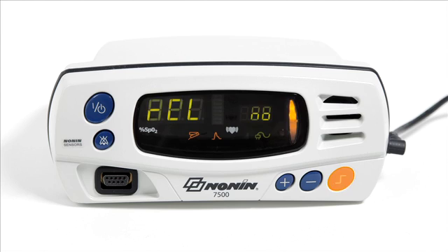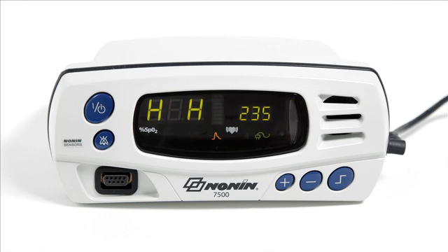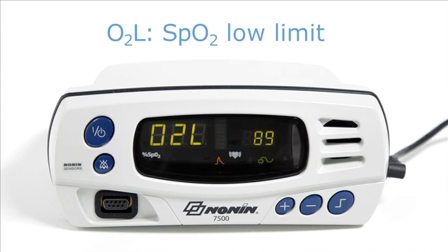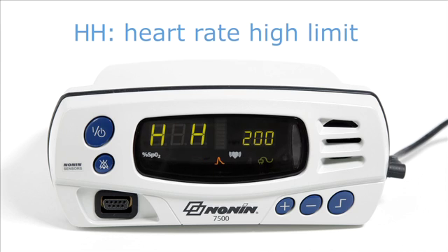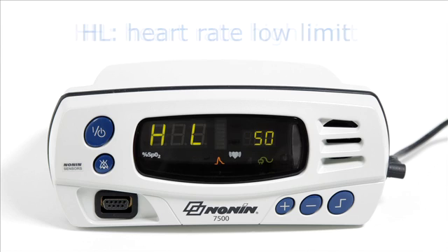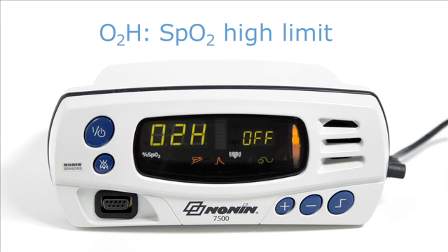You can proceed to the next limit value with each limits button press. Press the plus or minus button to increase or decrease the value to the desired limit, then press the limits button again to set the value and proceed to the next screen. O2L is the SpO2 low limit, HH is heart rate high, HL is heart rate low, and O2H is SpO2 high, appearing in that order.